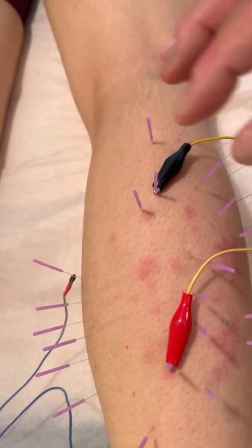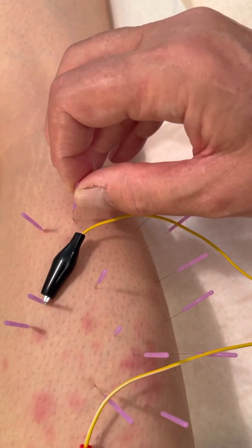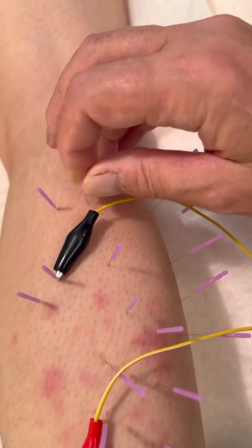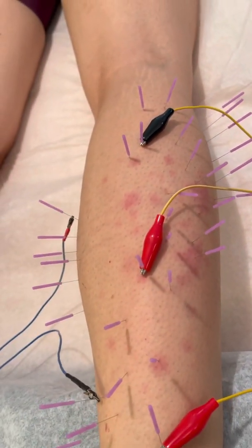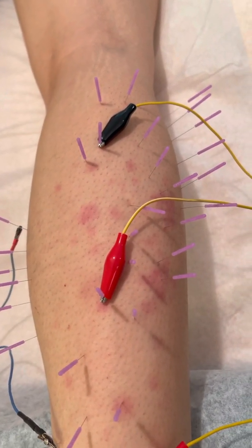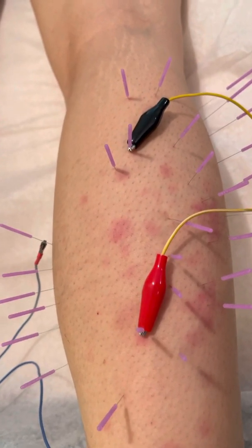and the pistoning technique, if you don't know what I'm talking about, it's when I lift a needle like that into the muscle and get it to release. I've already done pistoning technique on these points, and almost all of them had good releases. And so to add to that, we do this electrical stim.